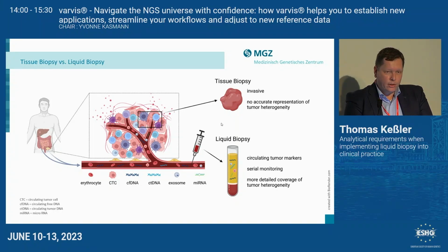So an alternative for getting information about the tumor is the so-called liquid biopsy. This is based on the principle that basically all cells in your body secrete small DNA fragments, and also the tumor does so.